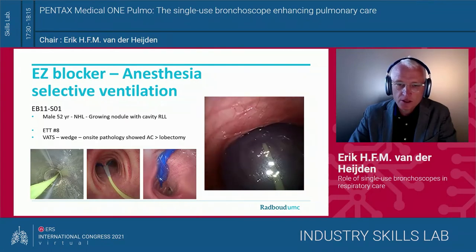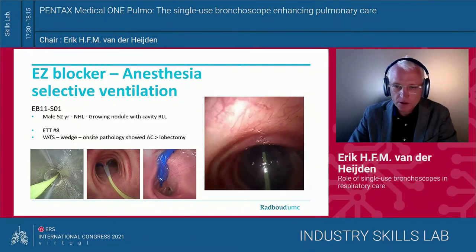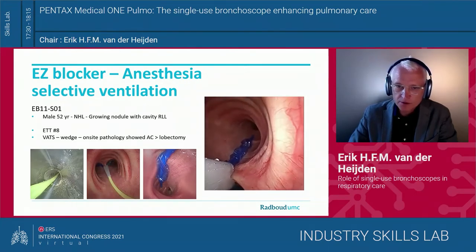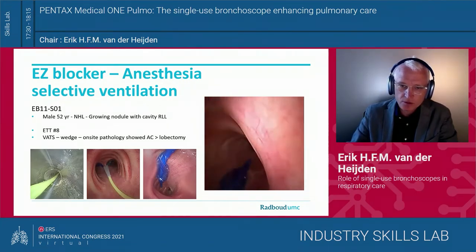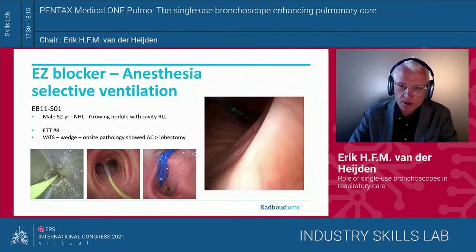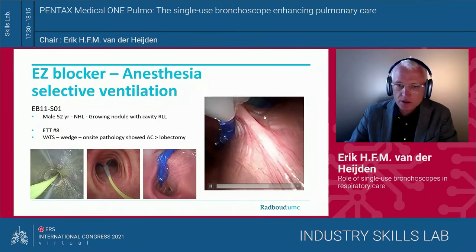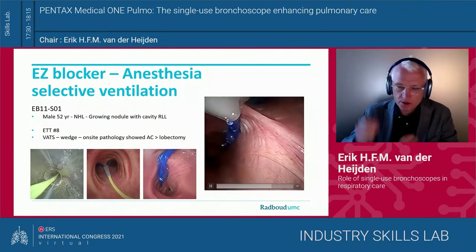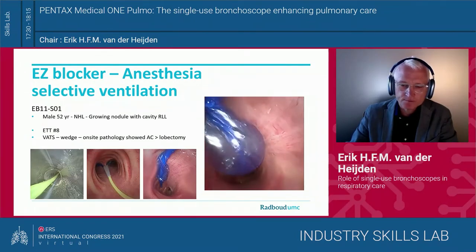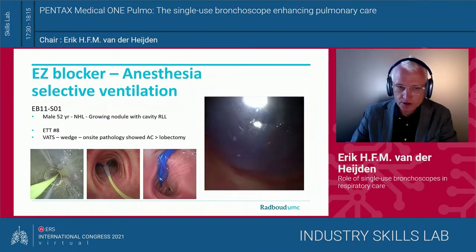And this is a check where you can see how much volume you need to instill in the balloon to block up the entire right lung. And they're marked with different colors. So the greenish balloon was on the right, and the very blue one is on the left side. That's difficult to see, but there's a marker here at the end, which has a different color, and that represents the distal part. So you can see which balloon you're inflating. And here you can see the inflation, then you are sure that the position is okay.